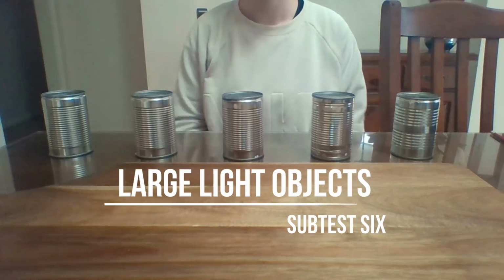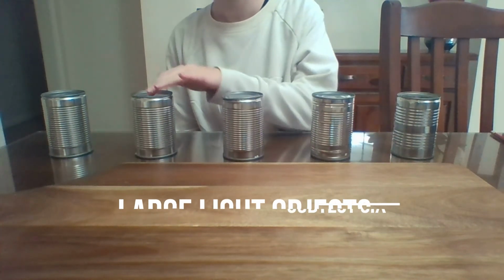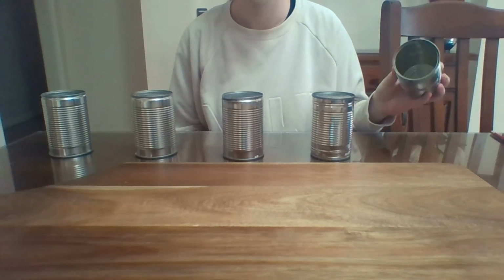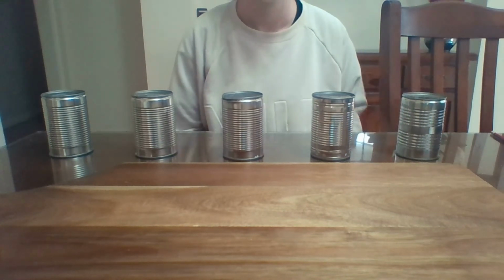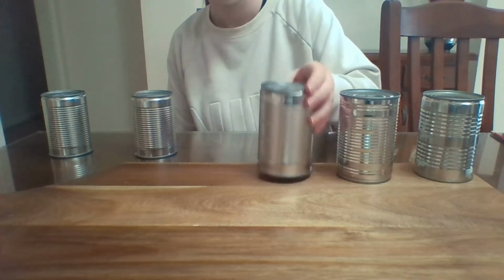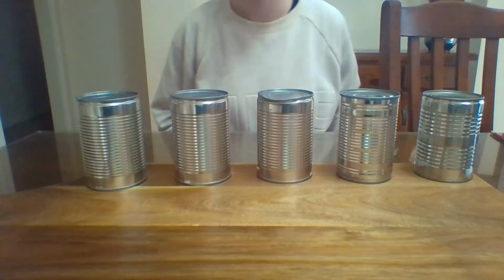5 empty cans are placed on the table 5 inches from the edge and all 2 inches apart. They are placed just in front of the board which is clamped to the desk, with the open side of the can facing down. The participant is asked to place each can on the board one at a time as fast as they can, while the assessor records the time. This is then completed on the dominant side, set up in the same way.